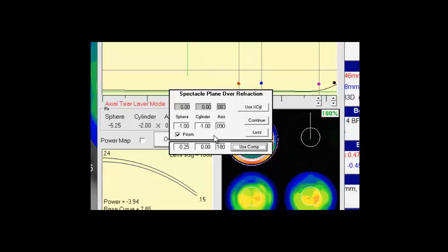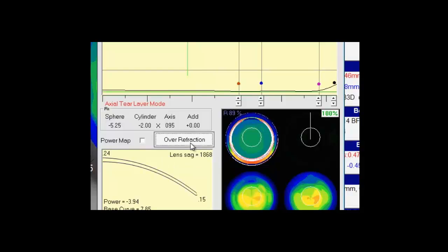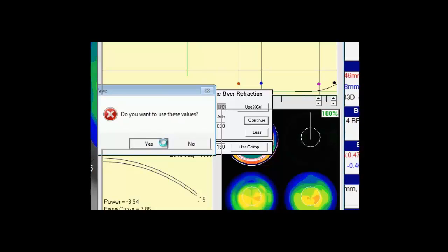In this case, I messed up and put too many values in there. So if I hit continue, it will ask me do I want to use these values. I can simply say no, and when I hit this box, I'll be back to my original. I'll hit more, add my compound over-refraction, hit use comp, confirm the values that I want, hit continue. Do I want to use these values? Yes.